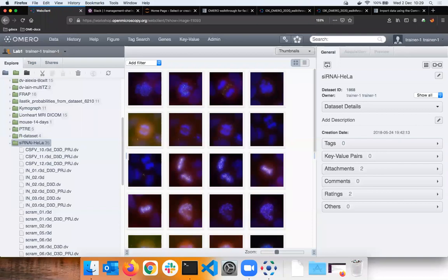Yeah, I don't really know what type of server we have to tell you, because we were lucky enough to have the IT guys set up things for us. But yeah, I think there's a limit to what they can do or they want to do, and so setting up things like scripts and stuff like this, I don't know if this is something we can do.